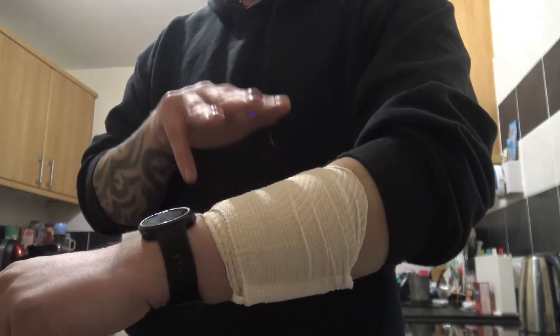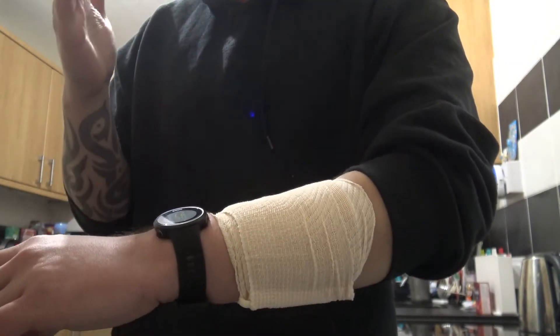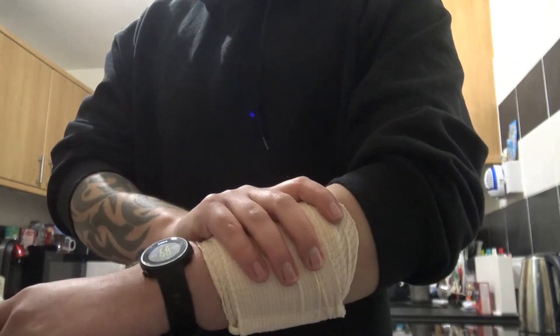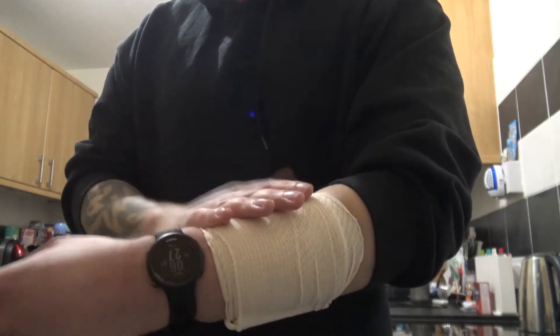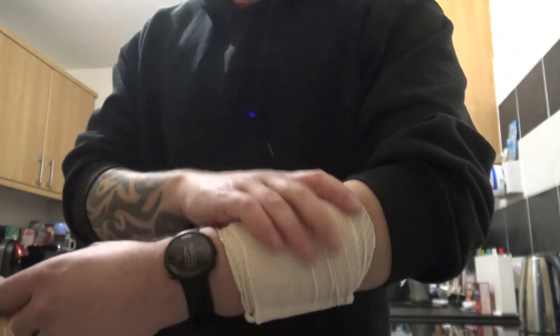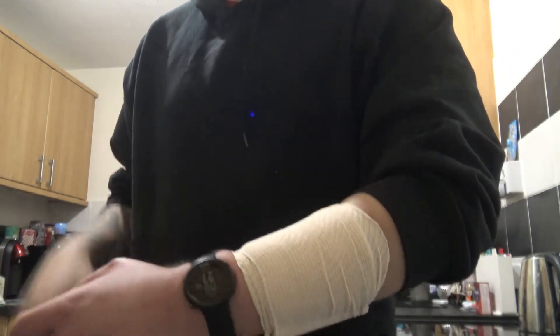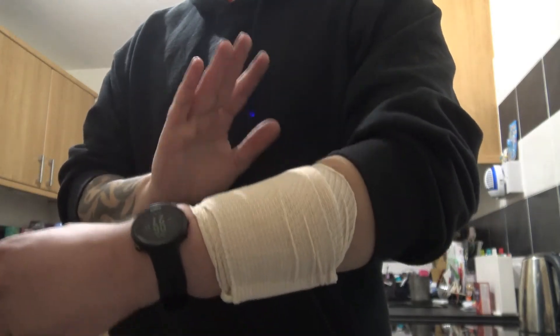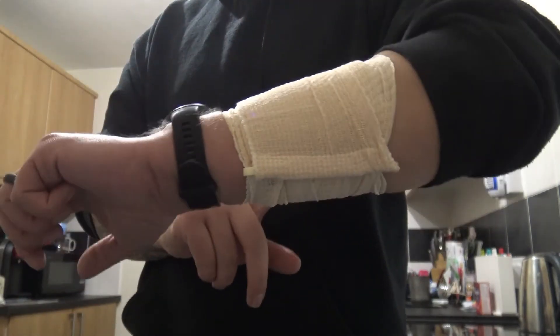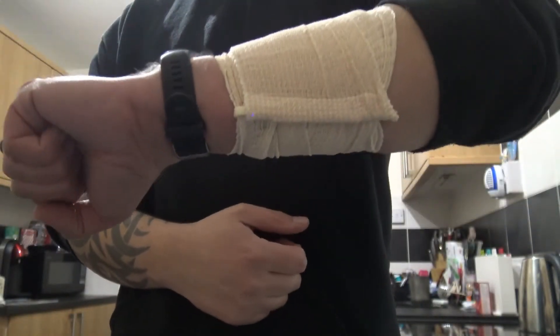This is four feet of elasticated bandage — perfect for animals, children, the elderly. If you are of a large build, you may struggle to get decent direct pressure on maybe an upper leg, but most situations it can be absolutely perfect. Really neat design, really slim profile and definitely worth its weight in gold, I think.